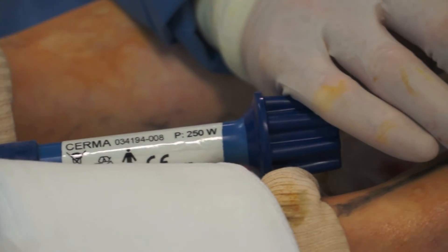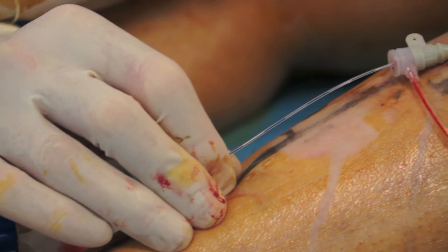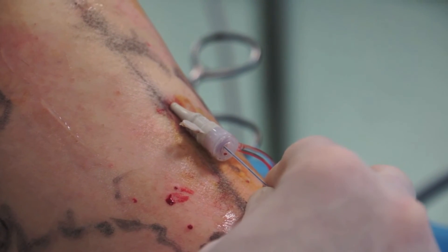The catheters are only 1.2 mm in diameter and therefore they do not require a guide wire for insertion.